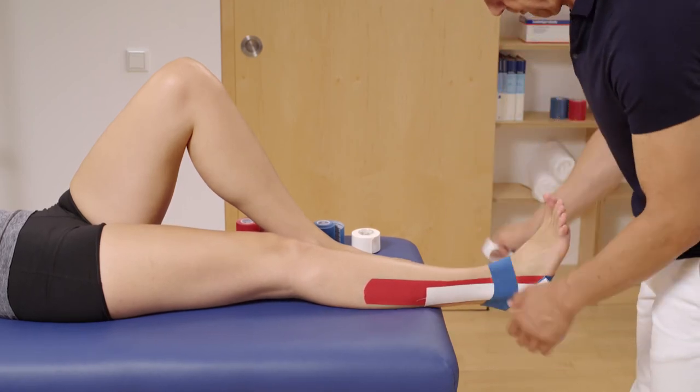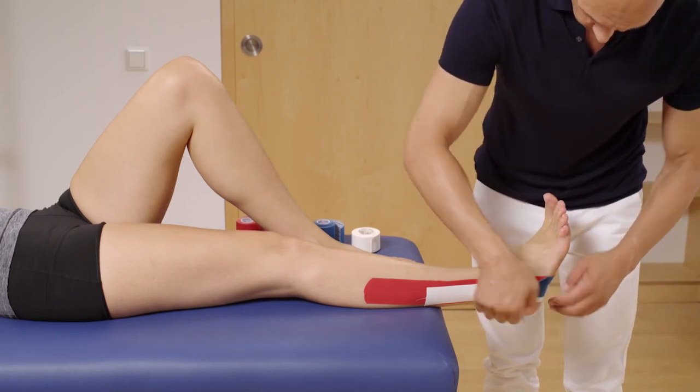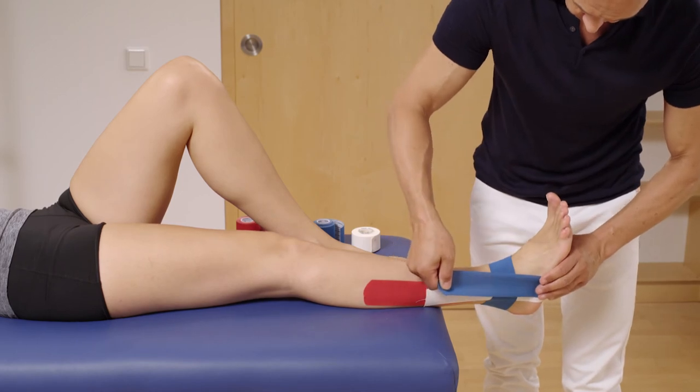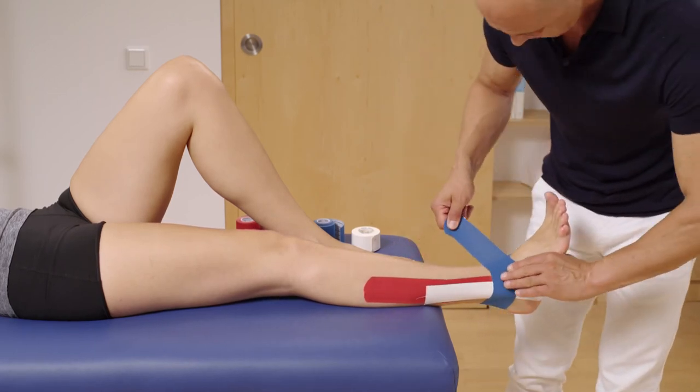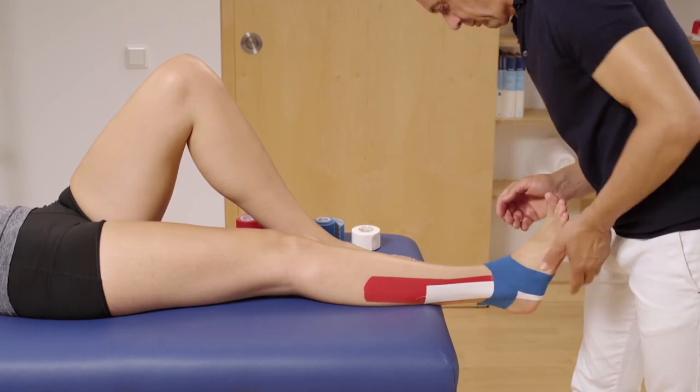Now do the same with the lateral part of the tape. Lay it around the ankle with about 50% tension and the end of the tape without tension.